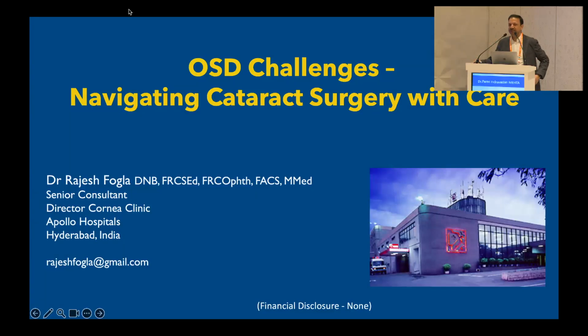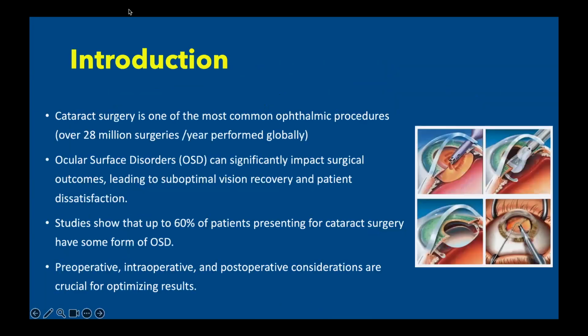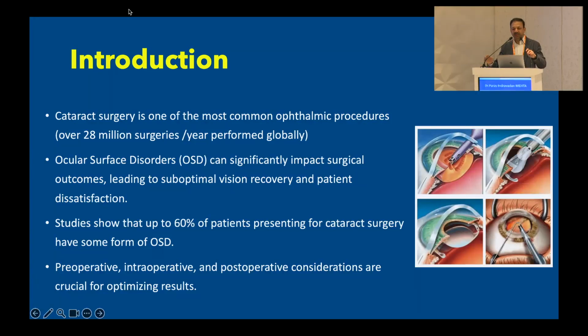So the topic Shweta has given me is navigating cataract surgery in eyes with ocular surface disease. Cataract surgery is one of the most frequently performed ophthalmic procedures worldwide. Ocular surface disease can have an impact on the outcome of cataract surgery, especially in this era when we use all the premium lenses where patients desire the perfect visual outcome.